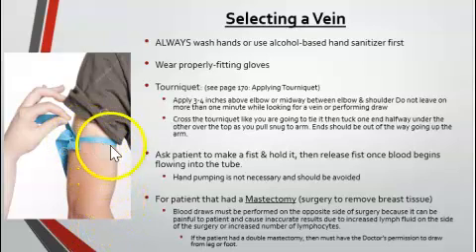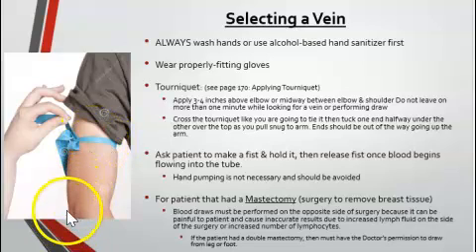And this is the correct area or placement of your tourniquet. You see the elbow here and the shoulders here, and this is about midway, or at least 3 to 4 inches above the elbow. You usually do not want to leave the tourniquet tied on the arm more than a minute, a max of 2 minutes before loosening it.